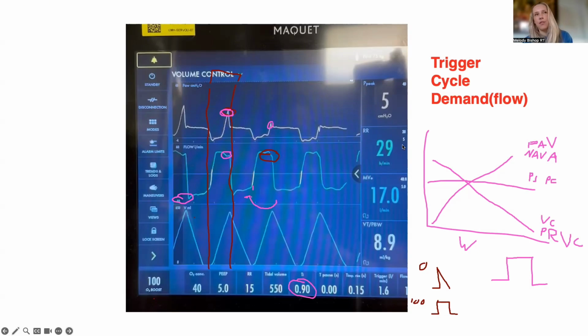I think there are hospital procedures and policies as well, but in RT school, technically we're taught to put our alarms 20% above and below what normal is. But I can tell you right now that that is not normal practice. Even myself, I tend to have wider alarms, but I am also a very present bedside RT. I don't round the minimum. I'm usually in the ICU every hour, if not more frequent. So I think there's that trade-off of it depends on the clinician and the patient.